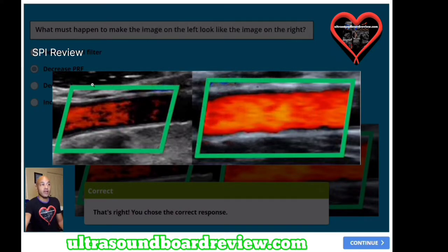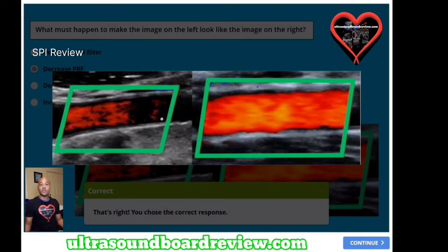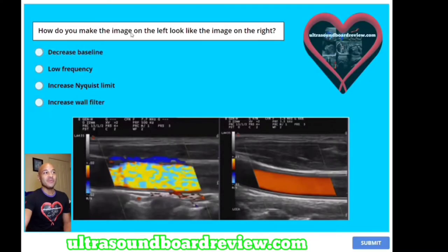You decrease PRF so that you can get pulses down into this deeper region here. Obviously the PRF is way too high to demonstrate any color Doppler in this region. Once we decrease that setting, you'll start to see color fill in this vessel. Also, you can lower your frequency as well.